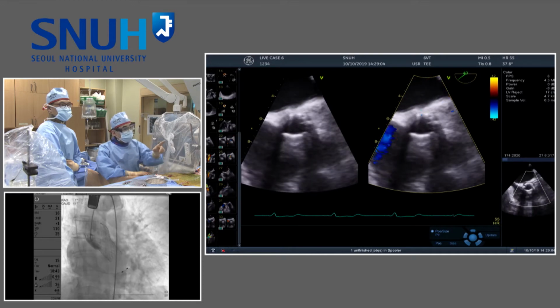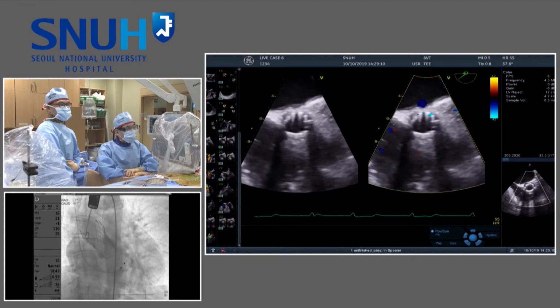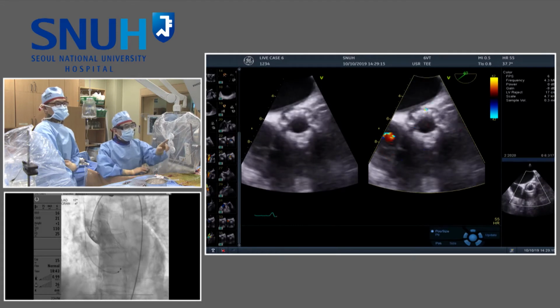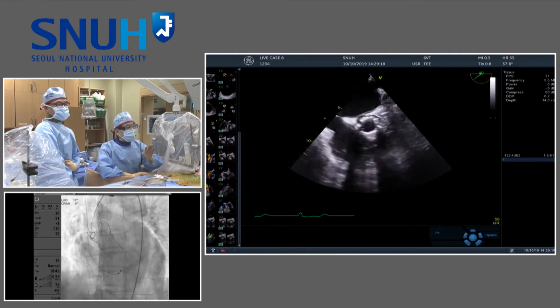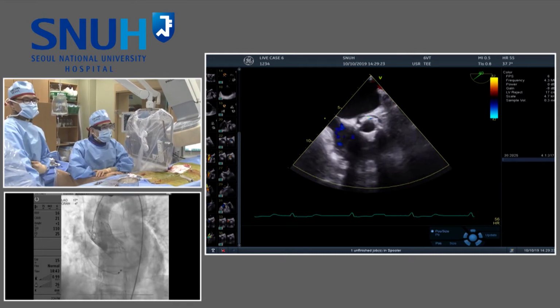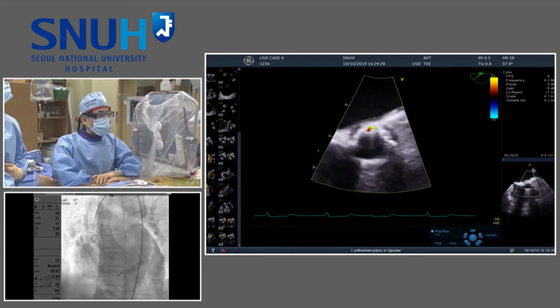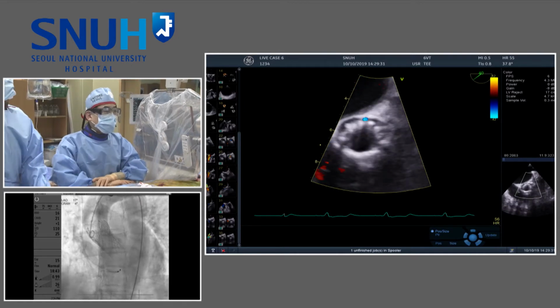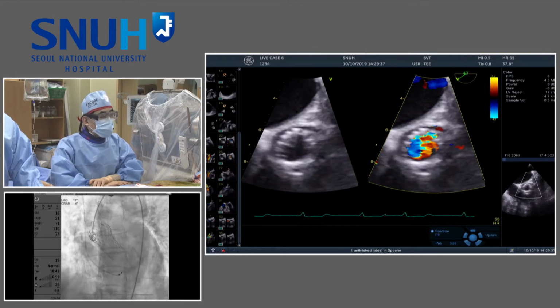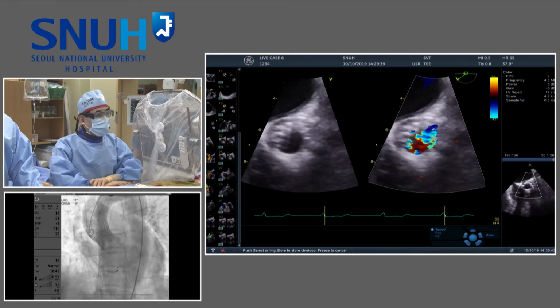But as you can see, negligible valve frame distortion, no under-expansion. Here, there is a subtle under-expansion of the NC distal frame, but it's acceptable. Actually, the regurgitant side is contralateral. Thus, considering such a complex situation, I am really a proponent of additional ballooning to correct an underexpanded valve frame, but in this case, it's not needed.